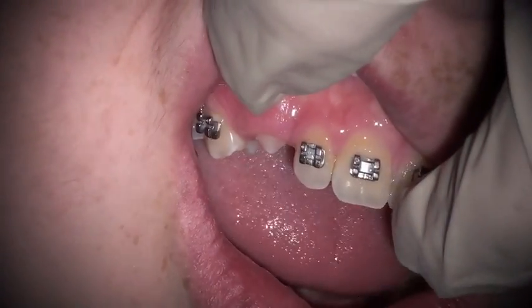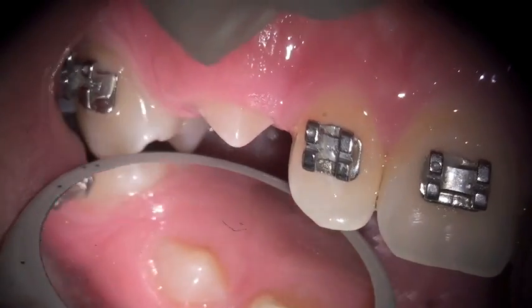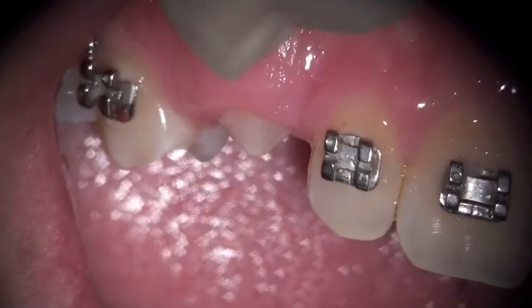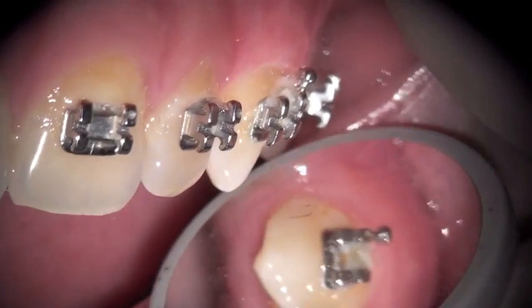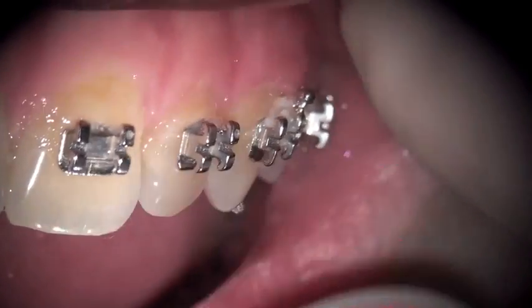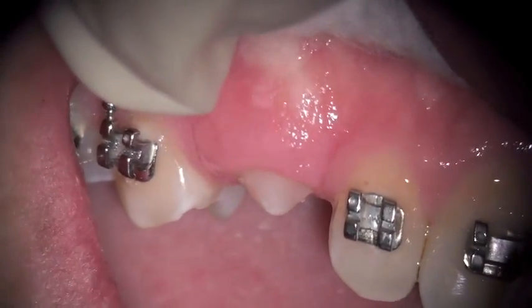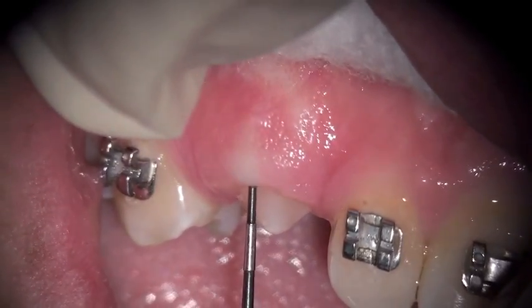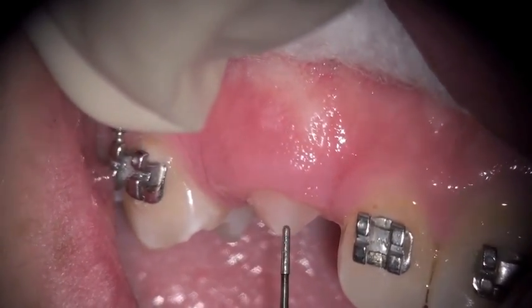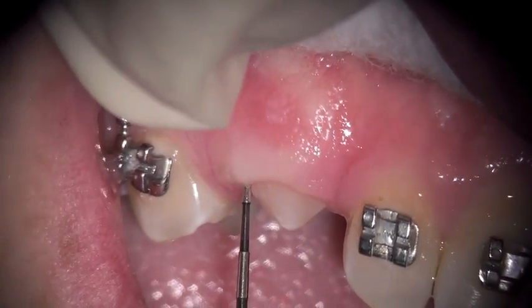We did a similar thing last time on the left hand side — you can see that the tooth is fully in now. So now we'll try the same thing on the right. If you hand me a periodontal probe, I'm just going to check this tooth and see how much attached tissue is off and underneath here.